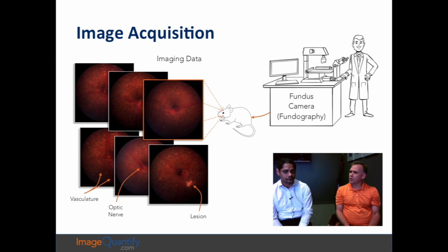When you're doing this in the preclinical space, obviously it's different, you can't ask a patient to sit still, right? These must be pretty small cameras. Yeah. And generally you'll have to put the animal under. Sometimes if you've got enough skill, you might be able to hold the mouse and take an image of it too. It just depends on what you're comfortable using. If you do a search on PubMed, you'll probably find a whole bunch of different ways of doing this. But you'll have to put gel on the eyes, make sure it doesn't dry out, and things like that.